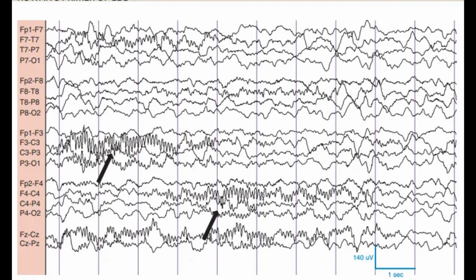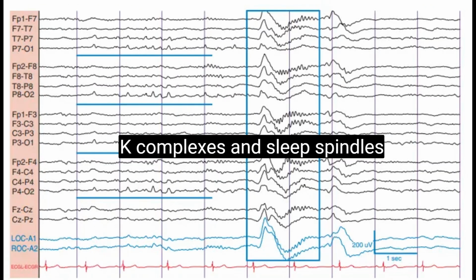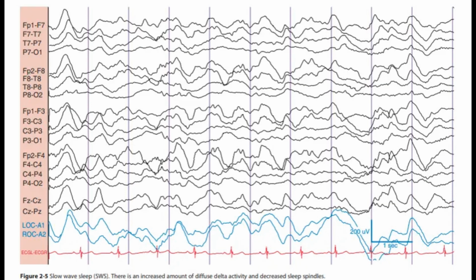Yeah, the subtle differences. All right, what about when we're sleeping? Sleep. We see a variety of different rhythms during sleep. So there are sleep rhythms too. Oh, yeah, this is great. One of the most prominent ones is what's called the delta rhythm. Delta? Those are slow, rolling waves that typically show up during deep sleep. So delta waves are like the brain powering down. You could say that, yeah.